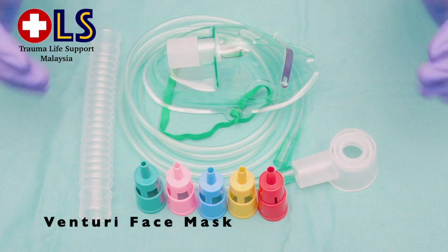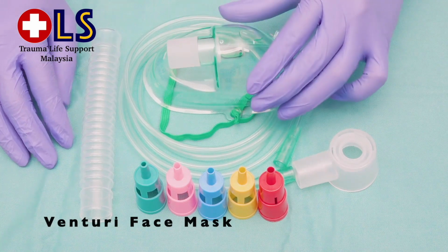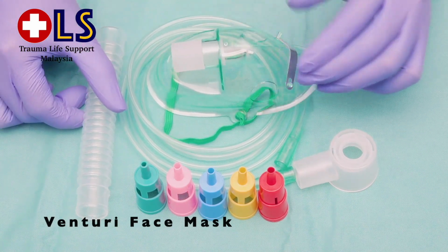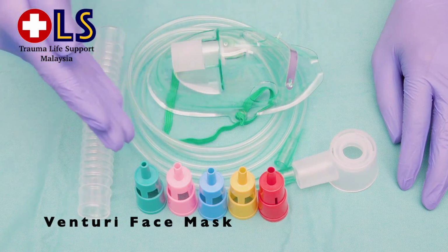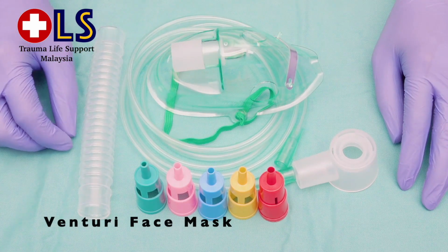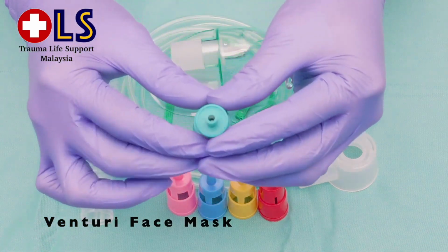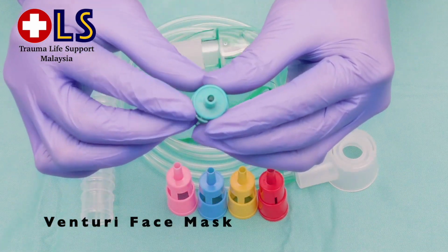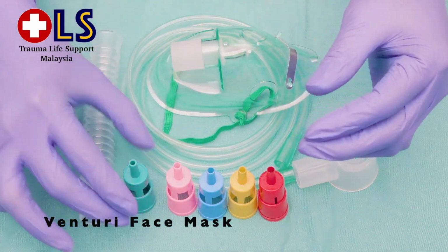This is a Venturi face mask. It gives us the flexibility to adjust oxygen concentration to be given to the patient. Choose the correct Venturi valve that is prescribed to the patient according to the color and FiO2 printed on it. It comes with the intended flow rate to achieve FiO2.